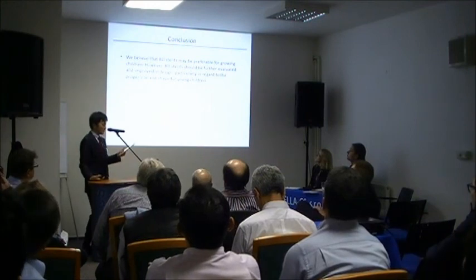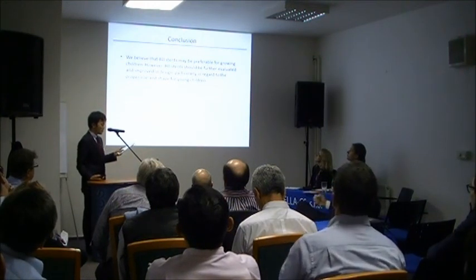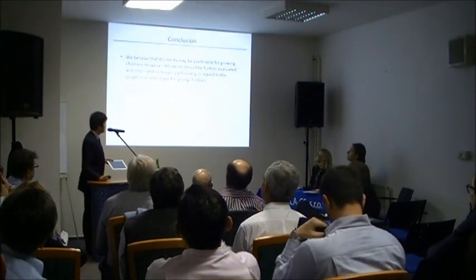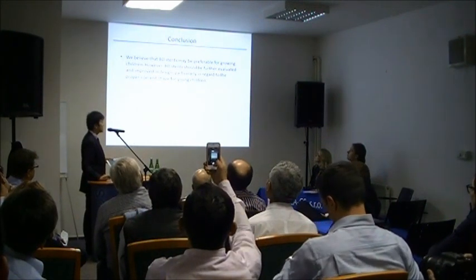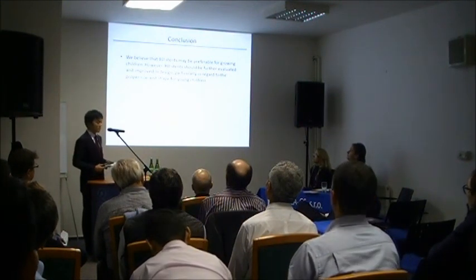We believe that the BD stent may be preferable for growing children. However, BD stents should be further evaluated in design, particularly in regard to the proper size and shape for young children.